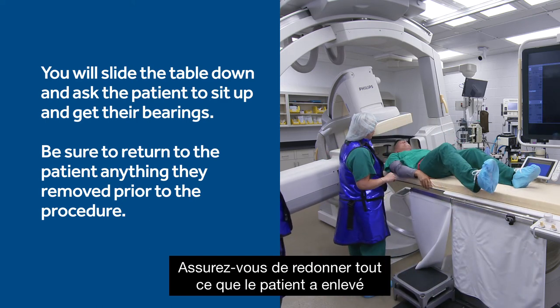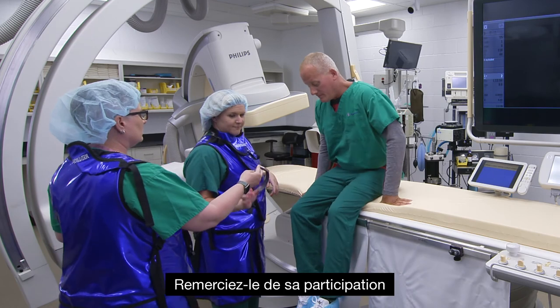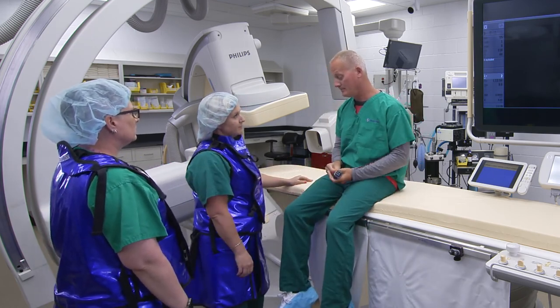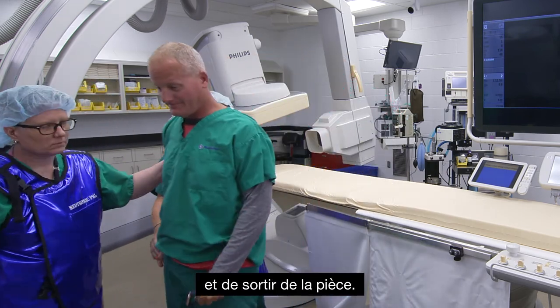Be sure to return anything the patient removed prior to the procedure, such as jewelry, watch, etc. Thank them for their participation and send them on their way. After all three data acquisitions are done, have the patient carefully get off the table and exit the room.